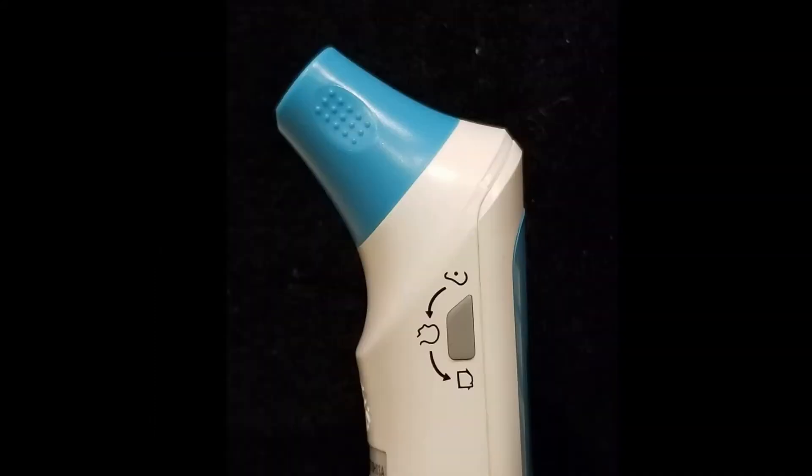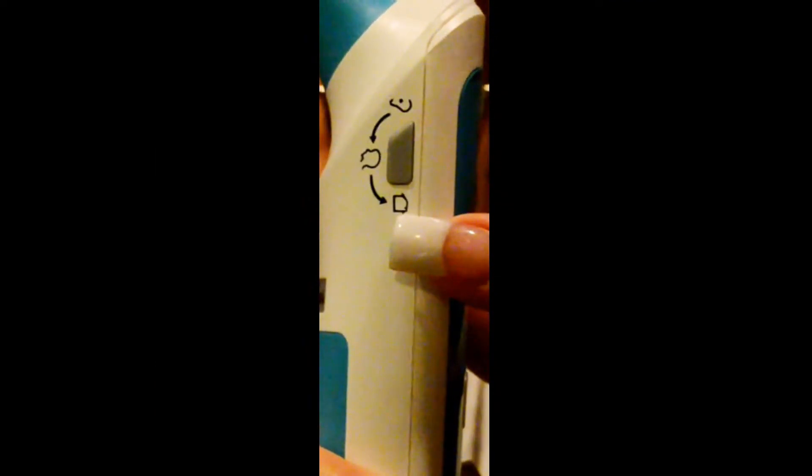Press this button again and it will take you to F3, which takes you to the room temperature that you can adjust. Now let's move on to the side. This button here takes your temperature from your ear, your forehead, or an object. Press this button and it will take you from ear, press it again for forehead, press it again for object.